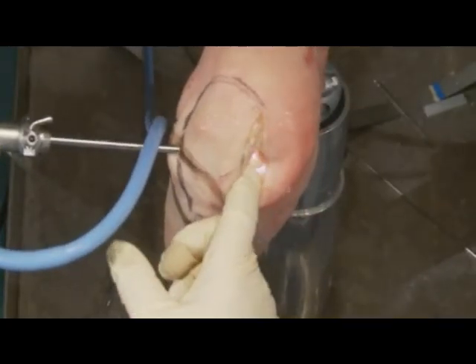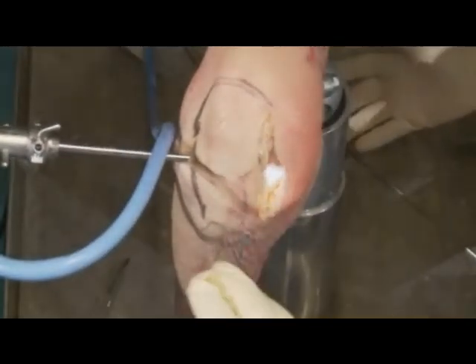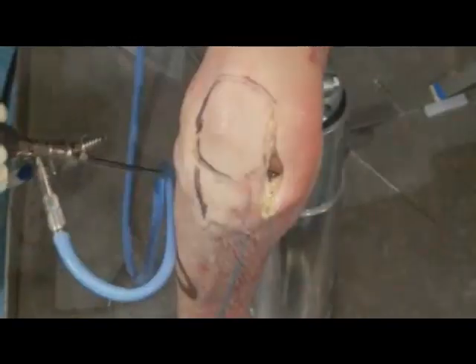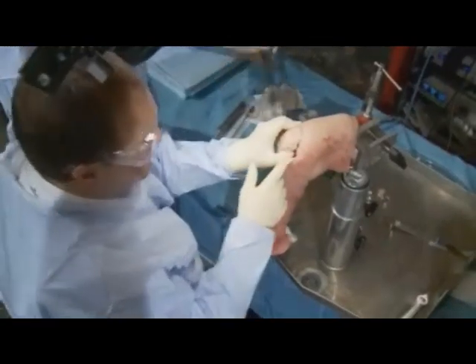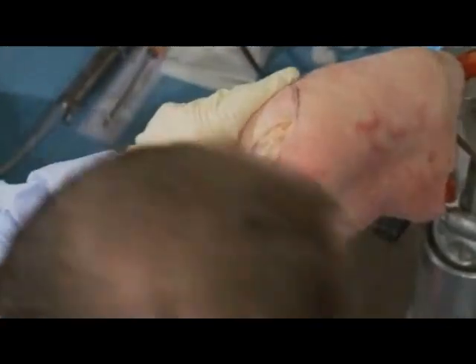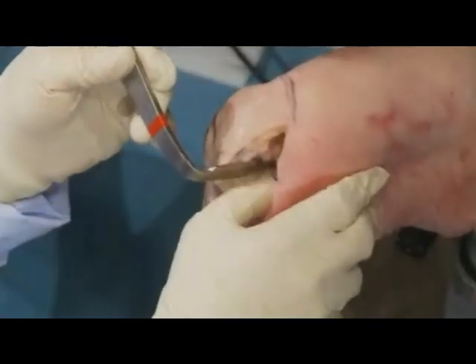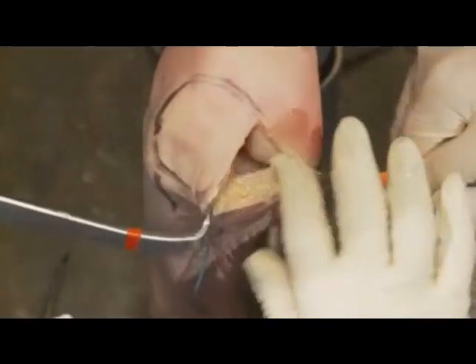So I take the patellar tendon, and we don't dislocate the patella, you don't cut the quads mechanism, and at this point we can turn off the water, suck it dry, and take our scope out of the joint. So we can go to the all outside picture at this point. Now, everybody has their own special retractors. All you need is something in the intercondylar notch to put beside the PCL to hold the patella out of the way.